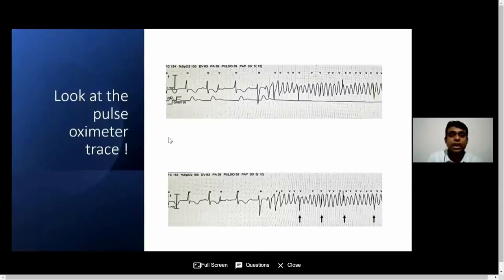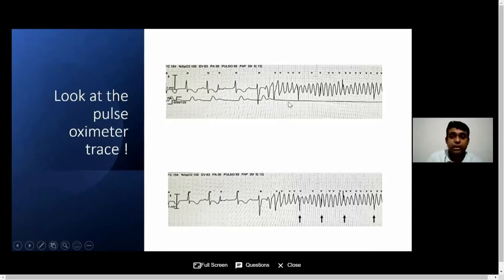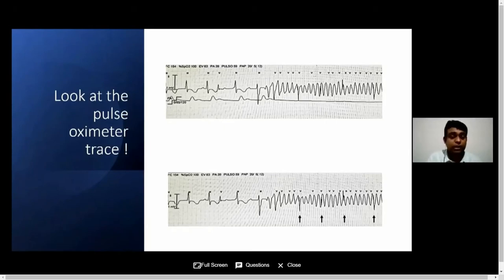Look at the pulse oximeter tracing — this patient has developed an abnormal fast rhythm. Look at the pulse oximeter recording: there was a nice deflection, but suddenly when the patient started to develop the tachycardia, the pulse waveform has gone flat. That means the patient doesn't have a pulse. This is an emergency situation — you need to start giving CPR.